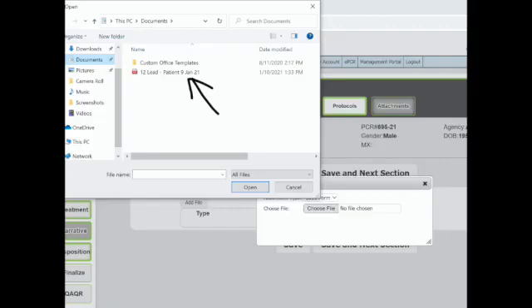7. Tap the Print icon and change the printer to Microsoft Print to PDF in the drop-down. Then tap the Print button. 8. Name the ECG record as appropriate, perhaps 12 lead, patient's name, today's date. Then tap the Save button to save the PDF in the Documents folder.